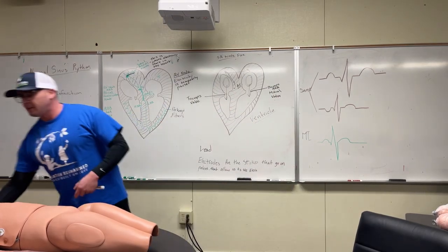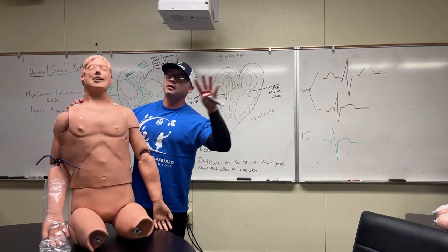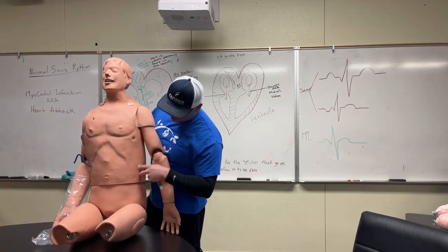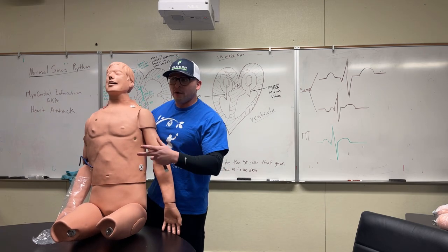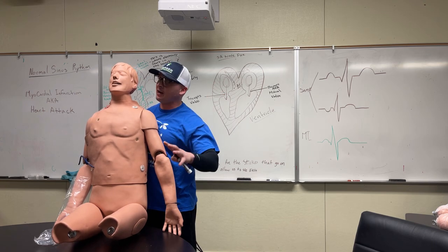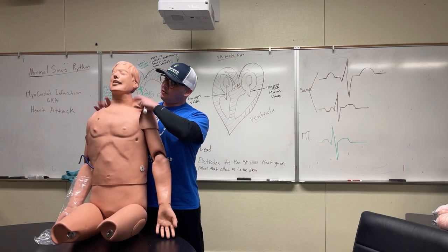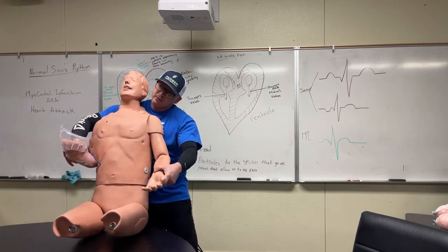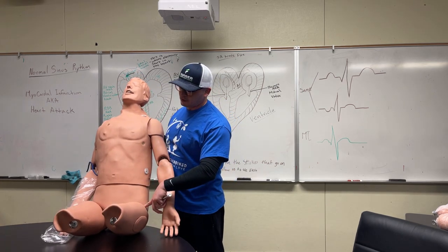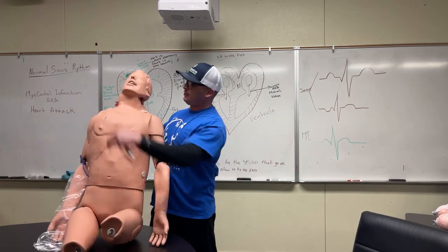So the stickies, the electrodes, this is perfect. At a minimum, you'll have 4, and they'll go either on the shoulders and down in the pelvic area, or right by the pelvic area. The other option, where I've seen it a lot, is they go on the limbs. So some paramedics or EMTs will put the ones that are here on the shoulders on the wrist, or they'll put them down here in the pelvis too. But you can put them here, here, here.